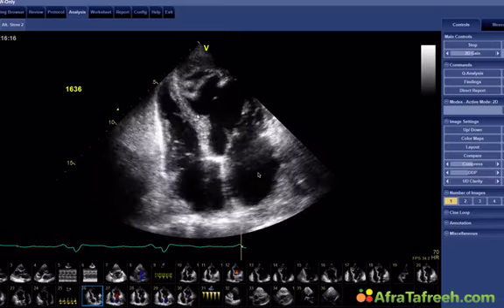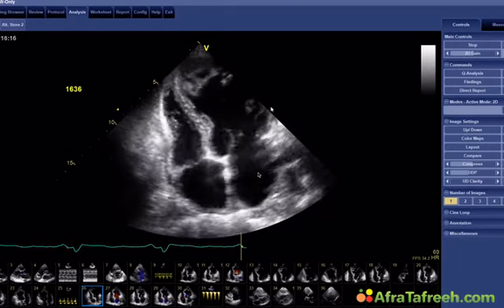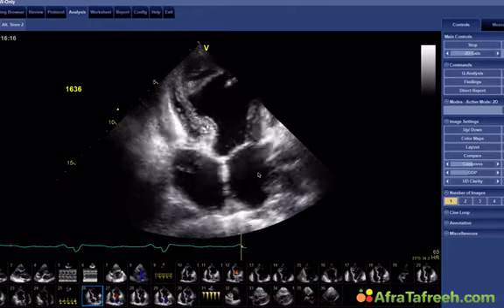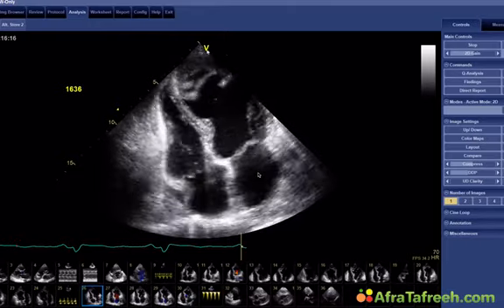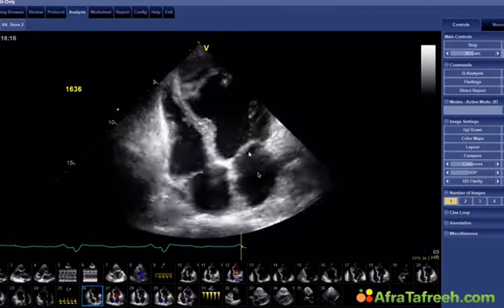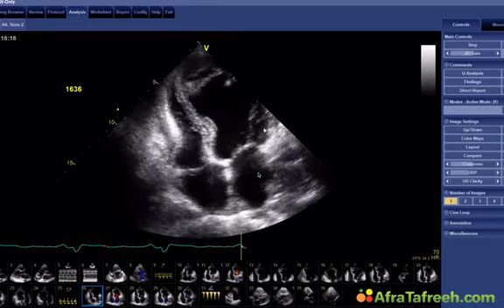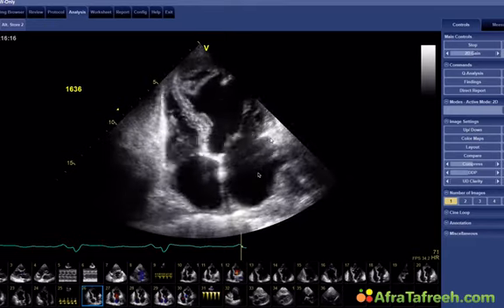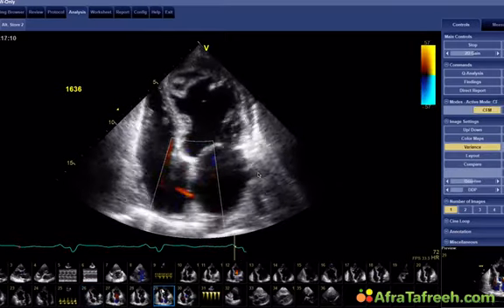This is where the name comes from. And it's a pathology that we are now more and more frequently aware of, and where we also know that some patients might not even have such severe and extreme forms, but sometimes only discrete forms where only parts of the septum or parts of maybe even the lateral wall are affected. So this is a case of Takotsubo.